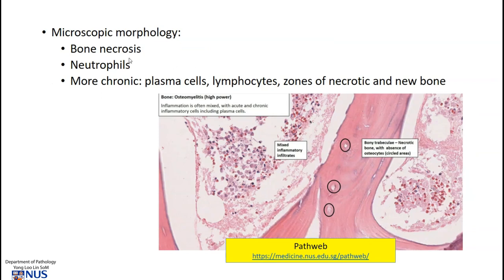Microscopically, we usually see bony necrosis. Here are the trabeculae of the bone, and within these spaces normally we would see osteocyte nuclei, but these are empty and devoid of nuclei — this is what necrotic bone looks like. Within the marrow space we can see a range of inflammatory cells depending on the time course of the disease; early in the disease we may see more neutrophils with their multi-lobed nuclei, and in the more chronic phase we can also see plasma cells, lymphocytes, and sometimes there is a zone of viable bone around the necrotic bone.